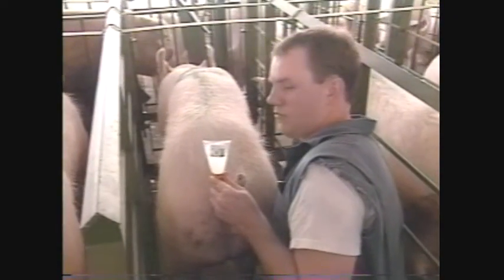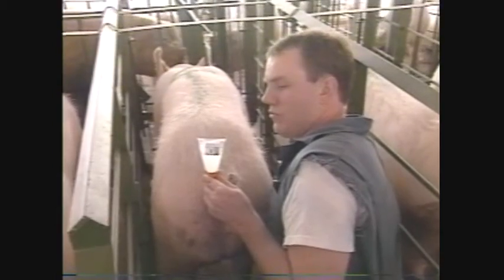A female in solid standing heat will often draw the semen into the reproductive tract without the need for the inseminator to apply any pressure to the tube or bottle. Undue pressure on the tube or bottle by the inseminator may result in backflow. An insemination can take several minutes to complete. Patience is essential. You must not rush the process.